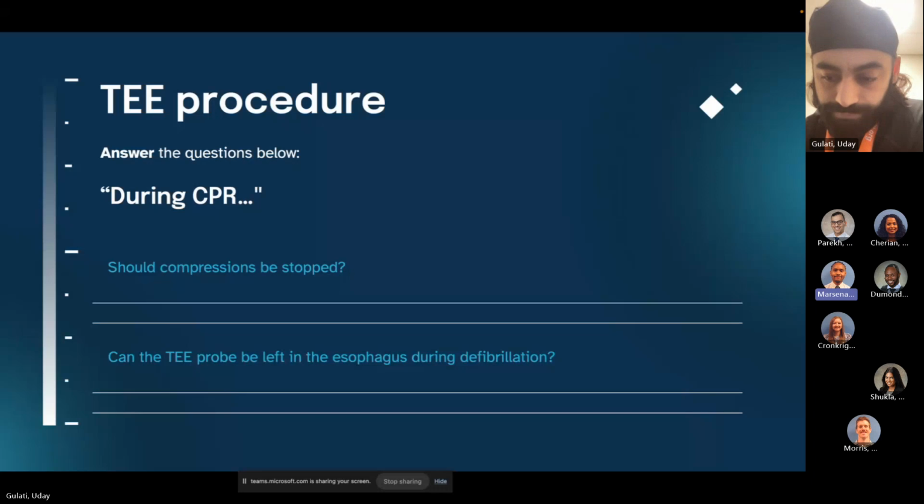You know what? Now you mention it, I'm pretty sure there have been patients where I got terrible views doing the TTE. Yeah, look at all your obese patients, right? It's very, very difficult to get good views, because the heart is just so far away from the chest. I'll always take a look, but a lot of the time I can spend another 10, 15 minutes on this patient, and even if I get some okay pictures, I would not feel confident making assessments that would affect my management based on those poor pictures, because there could be so many things I'm not seeing that could affect my measurements.